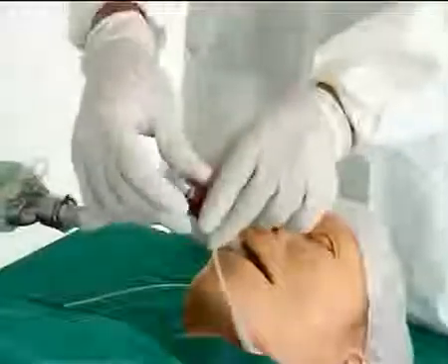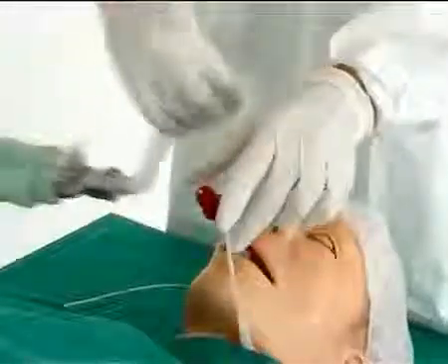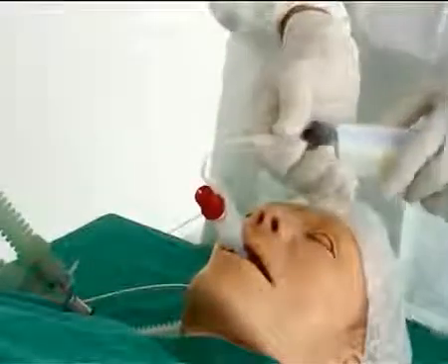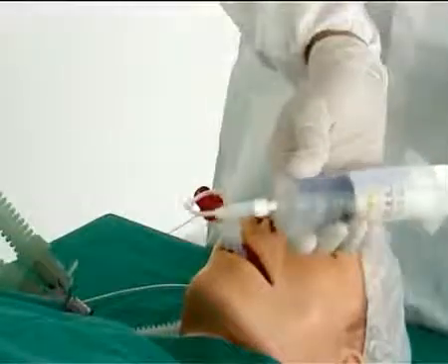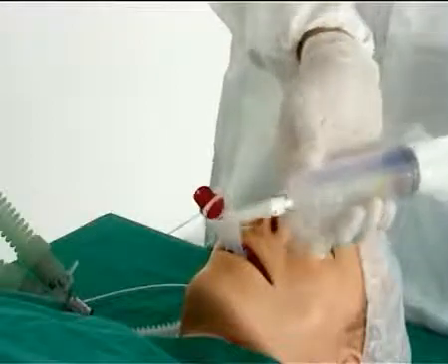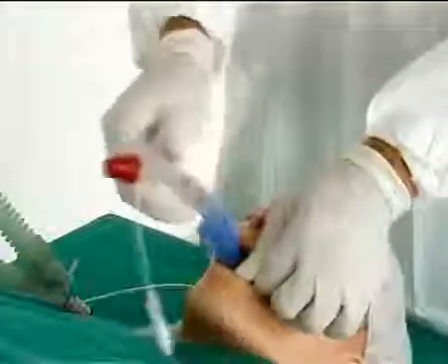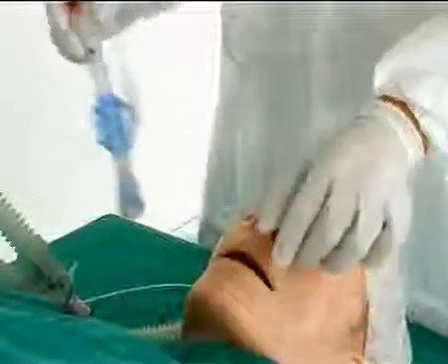At the end of the procedure, when the patient breathes spontaneously and the protective reflexes have returned, the LTS is removed. It is important that the cuffs are evacuated completely with the syringe before removal of the LTS to avoid damage to the cuffs.